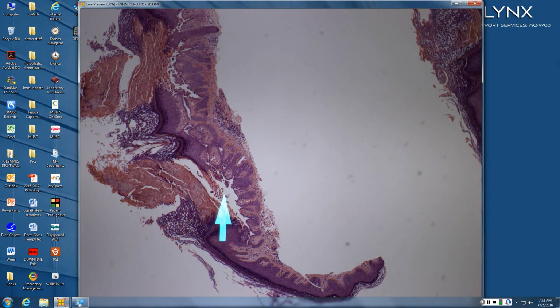He thought it was fungal. He thought he was seeing spores of some sort. He was wrong. But fortunately, he was very clever, and he waffled and said they were round bodies, corps ronds, right? And then the grains are the flat, dark things that resemble grains, right? And they are not corps grains. They're just grains. So corps ronds, grains.